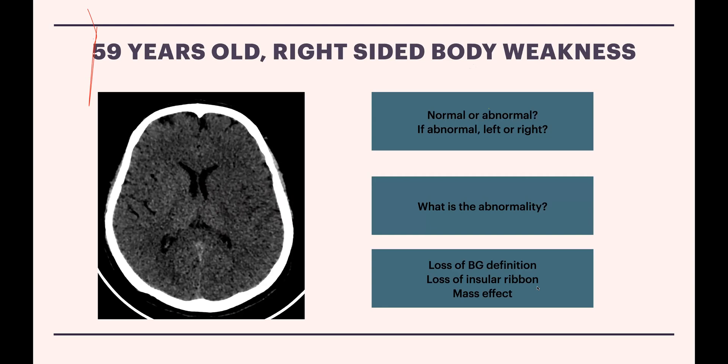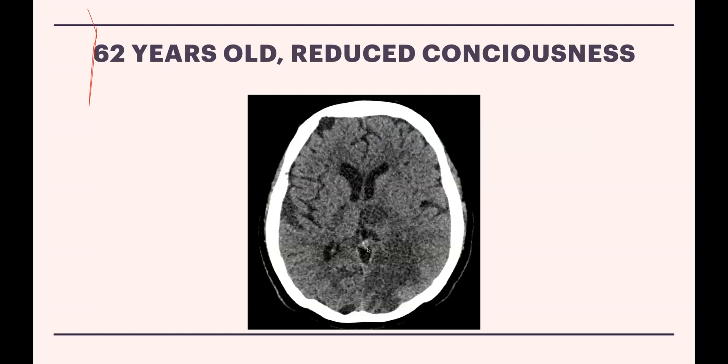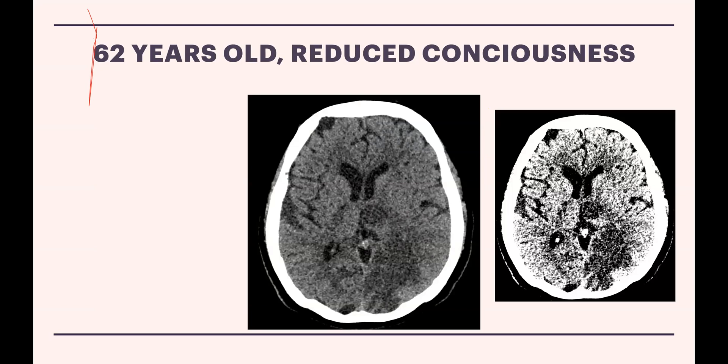Next case: 62-year-old with reduced consciousness. On plain CT the scan looks bizarre with just a dot here and there. Changing to the stroke window reveals one dot and a larger area — not in the MCA territory but involving the thalamus and the occipital lobes. This is a posterior circulation infarct involving bilateral thalami and the occipital lobes.